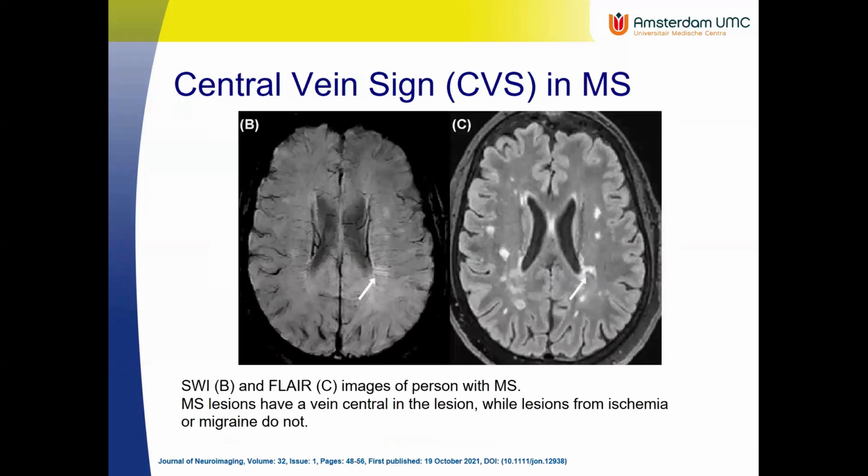So that's interesting. And there's another purpose, because even if the signal is within the blood vessels, the iron also disturbs the field homogeneity a little bit. So if you make the echo time long enough, you can also make the blood vessels, the veins, visible.